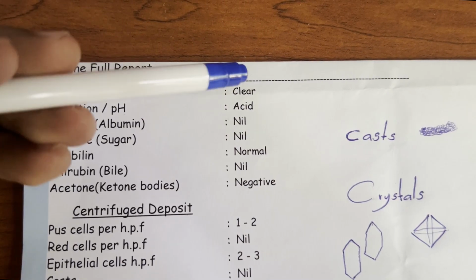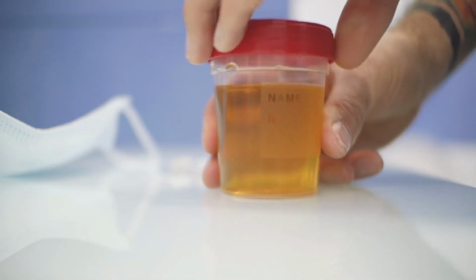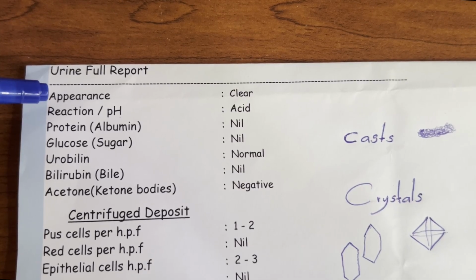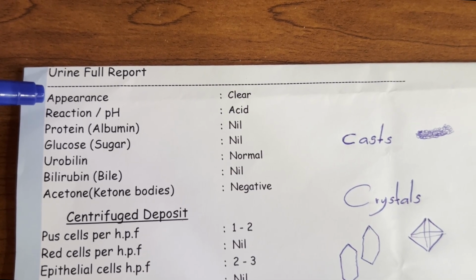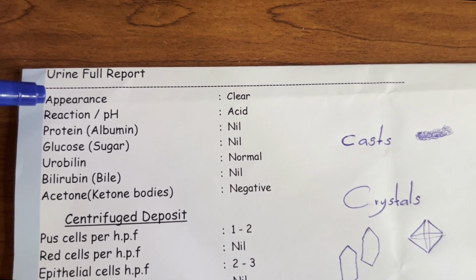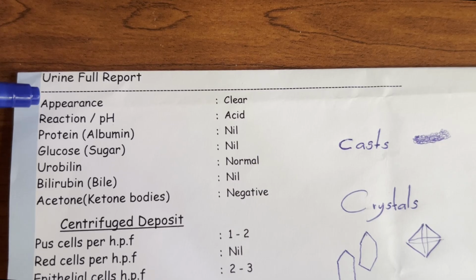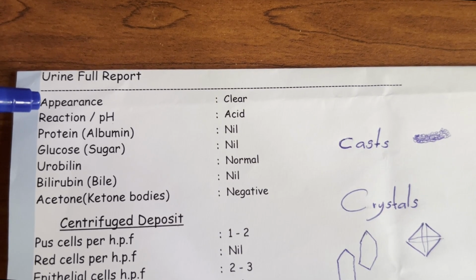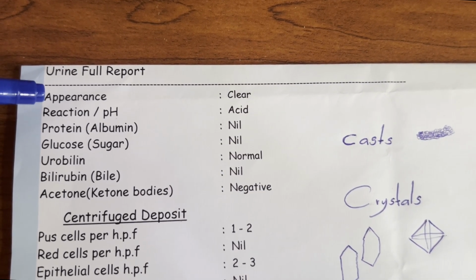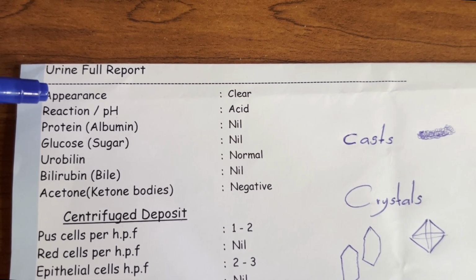We start with the macroscopic physical appearance. Normal, healthy urine ranges from pale yellow to deep amber and should be clear. In our report, it reads clear. Cloudy or turbid usually indicates suspended cellular matter such as high concentrations of white blood cells, active bacterial colonization, red blood cells, or precipitated mineral crystals. Red-colored points to intact red blood cells or free hemoglobin/myoglobin passing through the urinary tract.